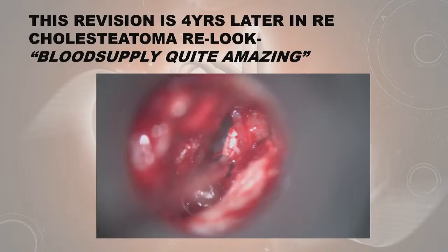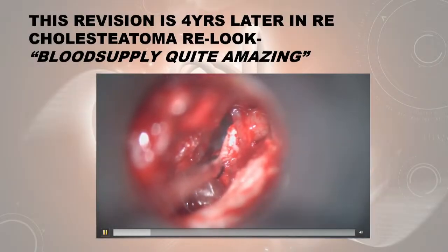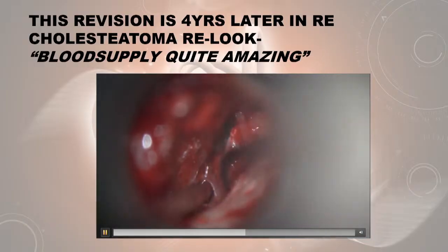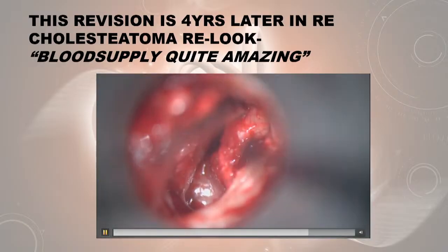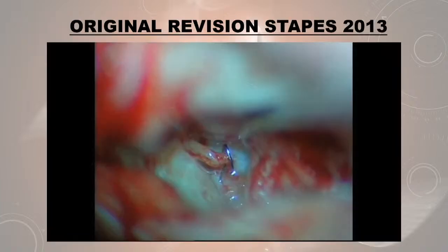I had to re-look in this ear four years later. This is the exact same ear. Have a look at that blood supply surrounding that cement. It's almost like it's got mucosa that's now vascularized. So that was a very encouraging thing to see.